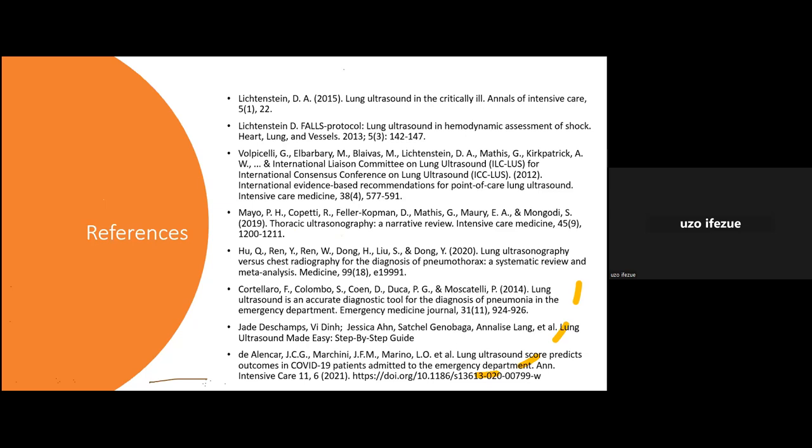Then he went on to talk about the advantages of ultrasound, how it reduces cost, reduces time constraints, reduces human error. And then he talked about the ultrasound machine itself, patient orientation and positioning, and probe selection, from the linear probe to the curvilinear probe. And then he talked about frequency and resolution, how low frequency will help us with deeper structures and high frequency will help us with locating superficial structures. Then he talked about the phased array ultrasound, the probe that is used for cardiac structures, and then the all-in-one, the Butterfly, which is a handheld one.